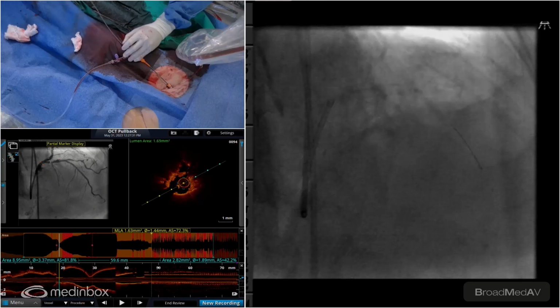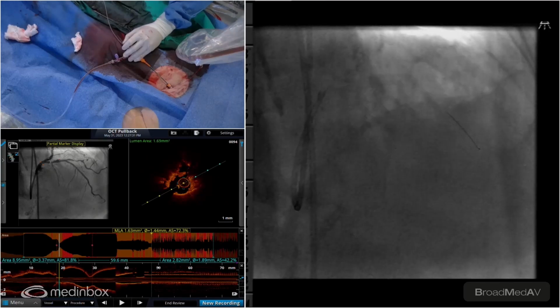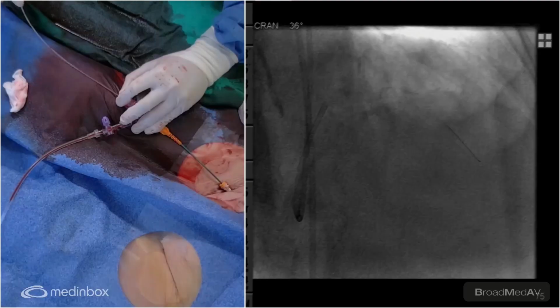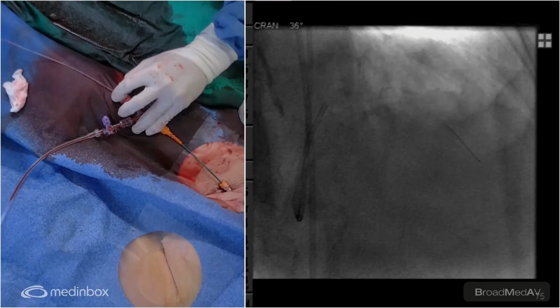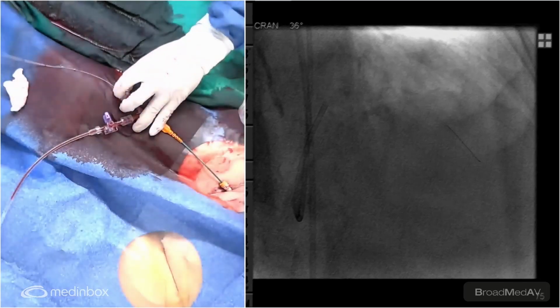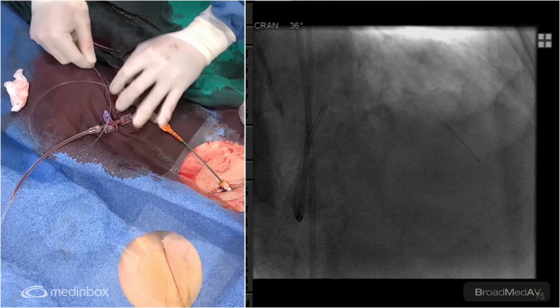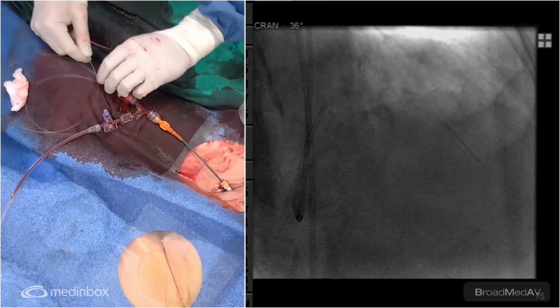No, I'm just going to wire it again. Oh, with a brand new wire? Yeah. Okay, we're out. Let's get the universal. He's going to do primary wiring. It's fine. Yeah, I was going to primary wire. I doubt there's any. We'll do a little puff, make sure. All right, Arjun, you're up for the puffs there. We'll get the stuff ready for you.